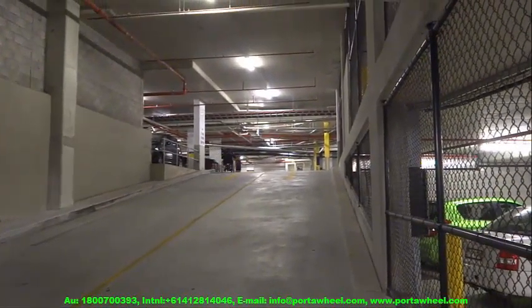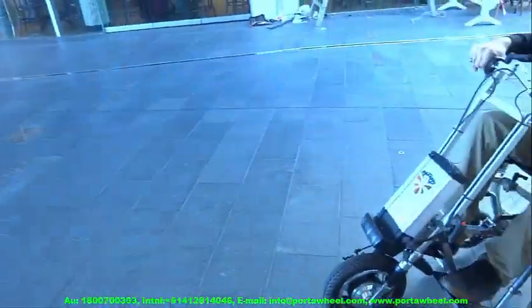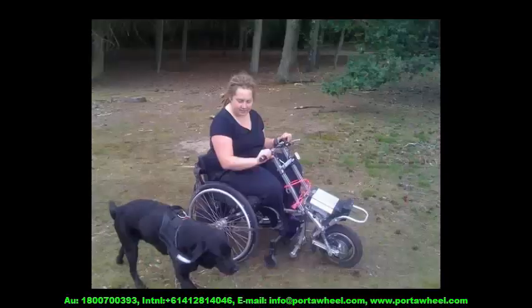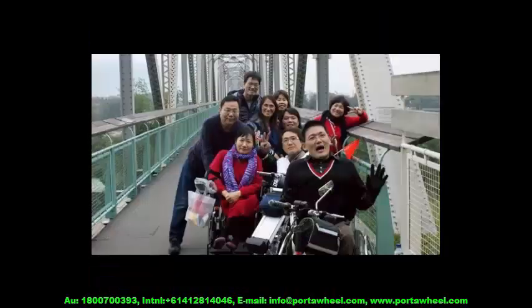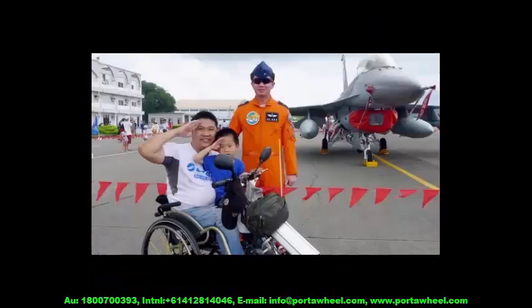Obviously, the width of the wheelchair it attaches to determines how manoeuvrable it is indoors. The PortaWheel also ships with all the brackets and attachments required for both narrow transport wheelchairs as well as wider wheelchairs, and accommodates wheelchairs made of round tubing as well as elliptical tubing.